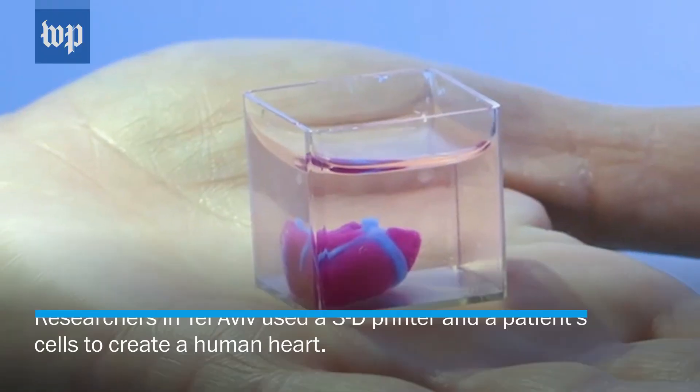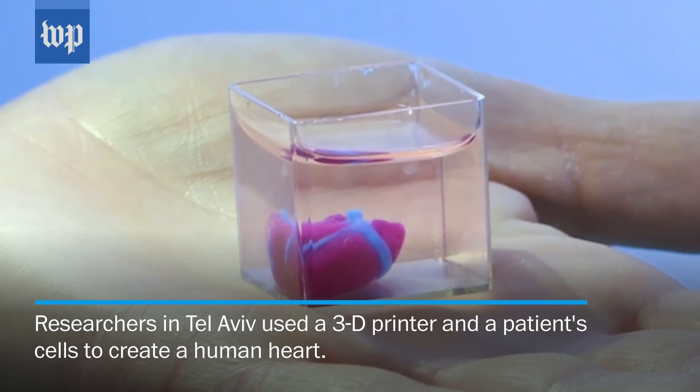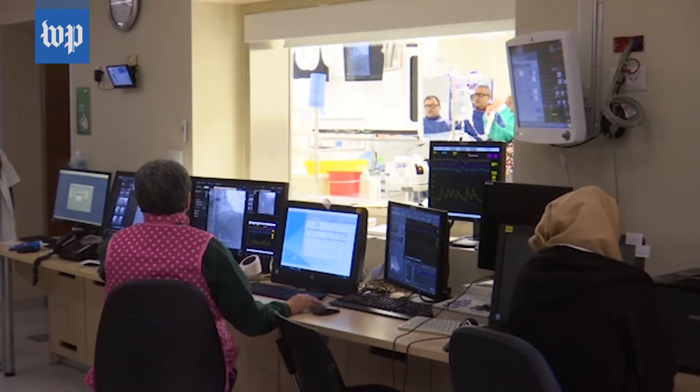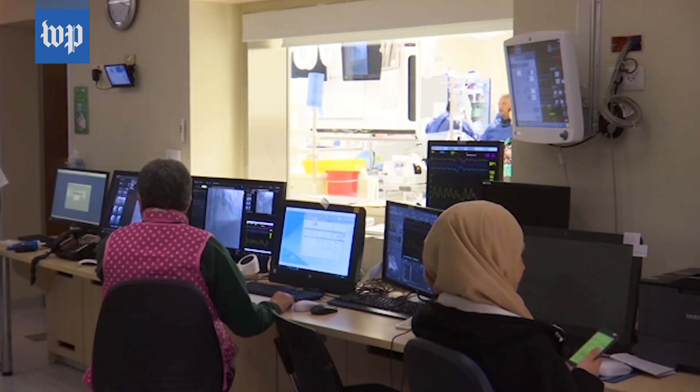This is the first time that a whole cellular heart with blood vessel is printed. It is based on a small biopsy that is taken from a patient. The cells and the biomaterial from this tissue are separated.